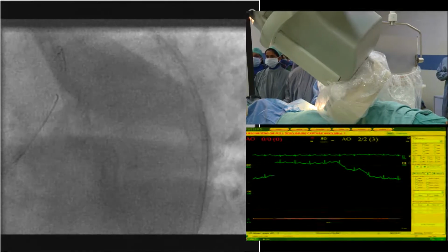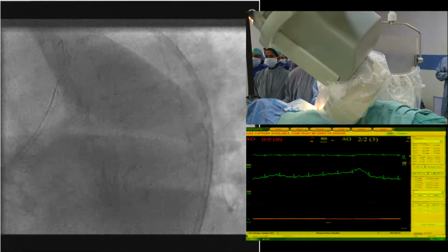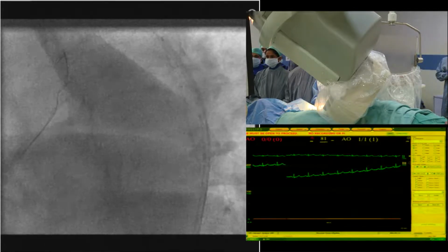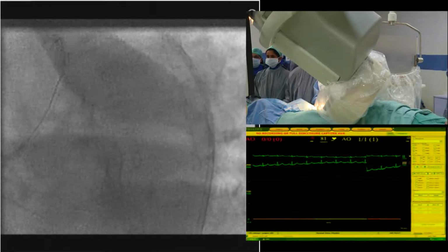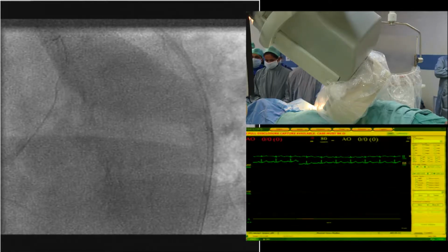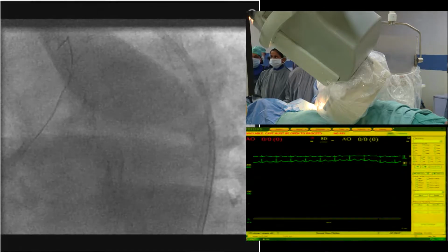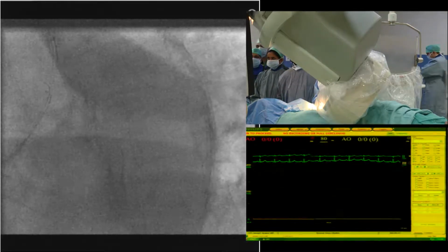And the other thing is that even in cases like this, we can use OCT without contrast. I can describe the technique more in depth at 7 o'clock this evening. It is very useful to prevent contrast-induced nephropathy because we know contrast-induced nephropathy is ominous.